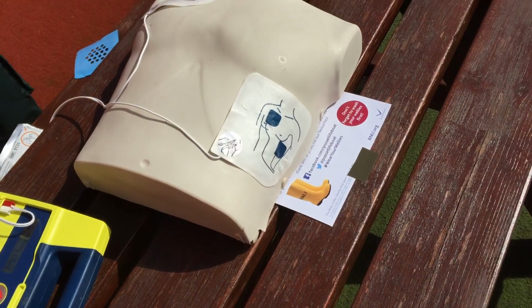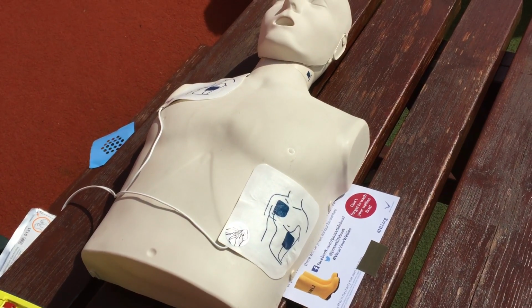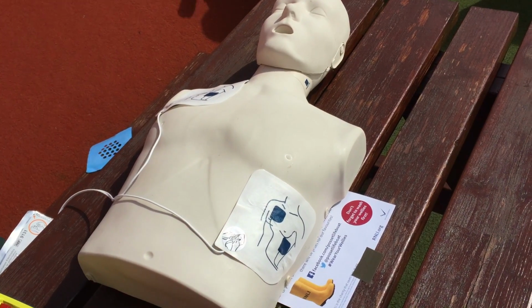Do not touch patient. Analyzing rhythm. So now the machine is actually analysing. Everybody needs to be clear from the patient, not touching.